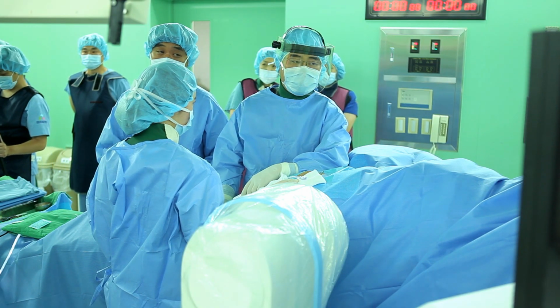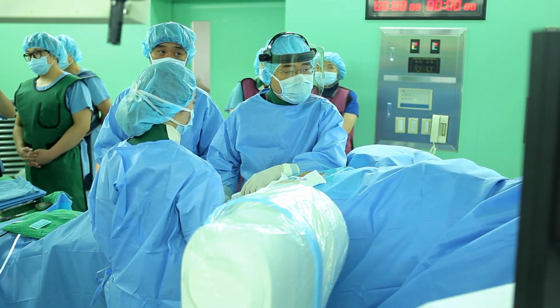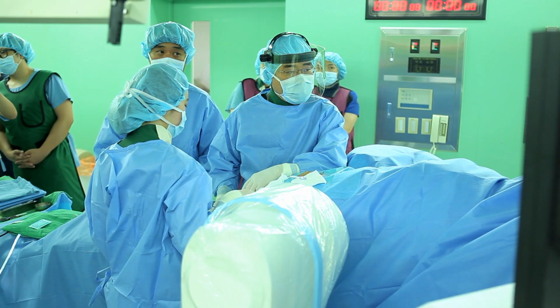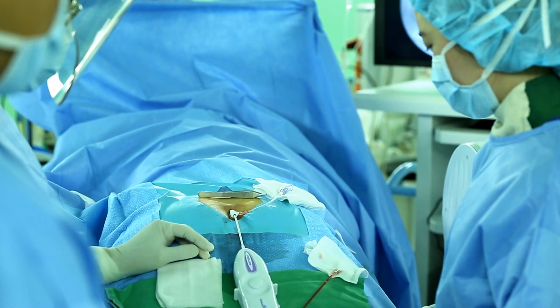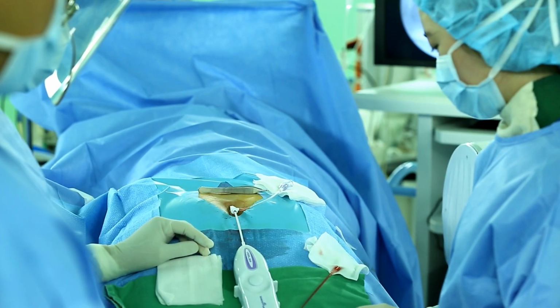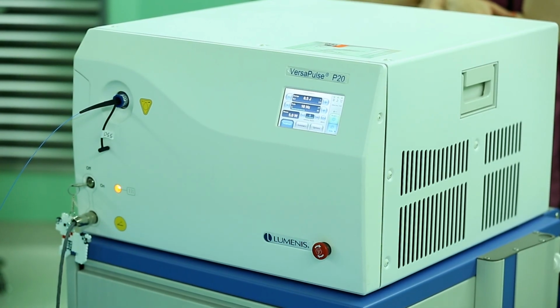The patient may complain of an intolerable heat sensation, although the laser fiber is not touching the nerve, while it is being injured by thermal energy. Then, you should irrigate saline to cool down the temperature around the nerve. This is an additional tip for you.